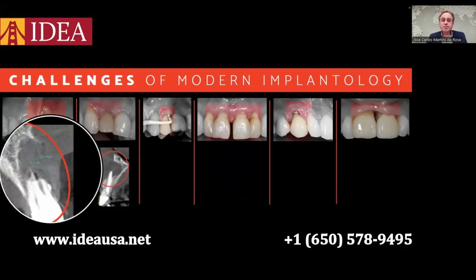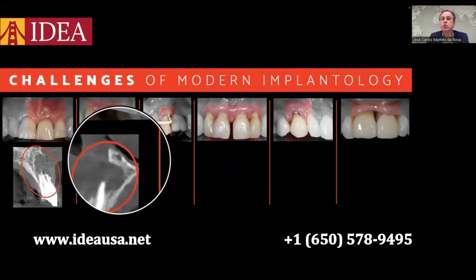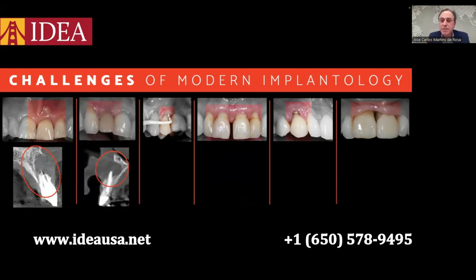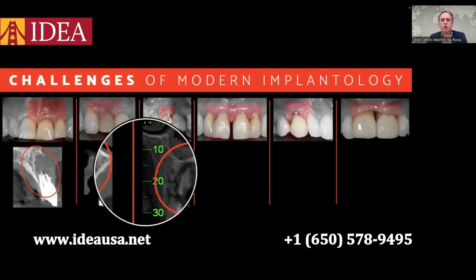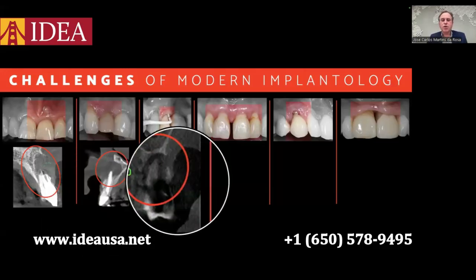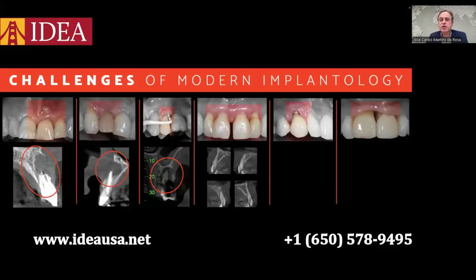But the question is, how to stabilize the implant in very tiny bone like this in order to put the implant in place, to make my provisional restoration and bone reconstruction simultaneously. This next clinical case in the premolar zone, we have no buccal wall, no palatal wall, and only the sinus floor remains. This is a periodontally compromised patient.